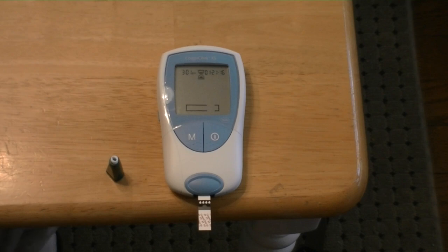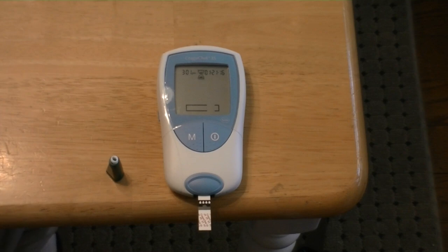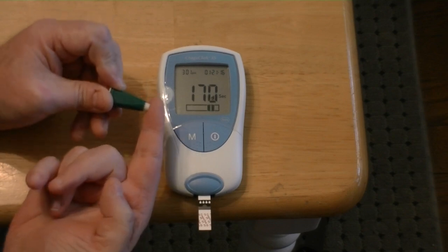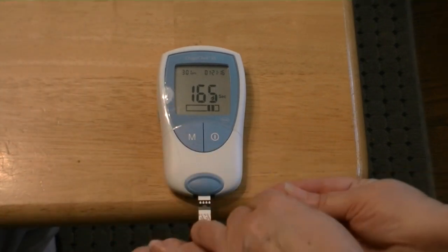Once it comes on, it's going to give me approximately 179 seconds — which is almost 3 minutes — in which to deposit blood on the little divot on the machine. My wife likes to help, so she's going to squeeze the blood on my finger, because a lot of times it doesn't like to come out. So you take your finger, find a spot — not on the side but more towards the center — and you push down on this. It clicks, and then hopefully you get blood out of it.